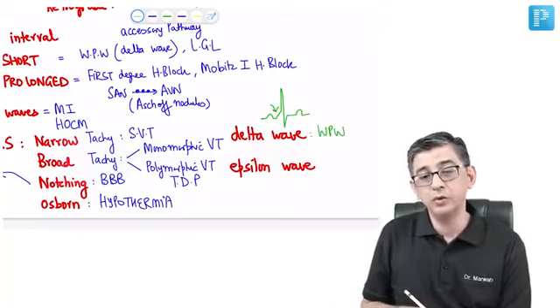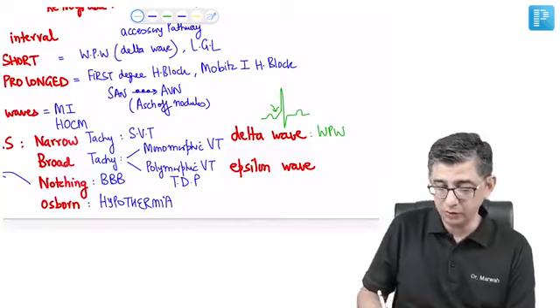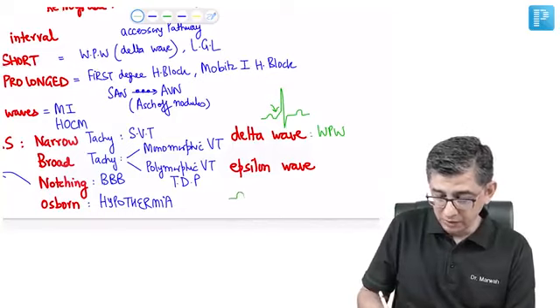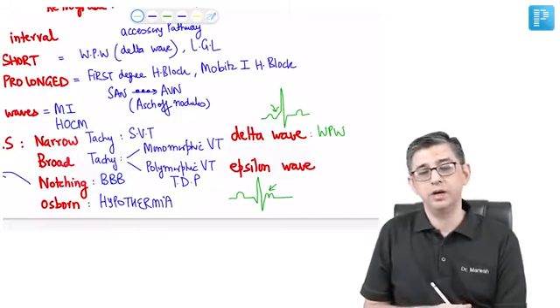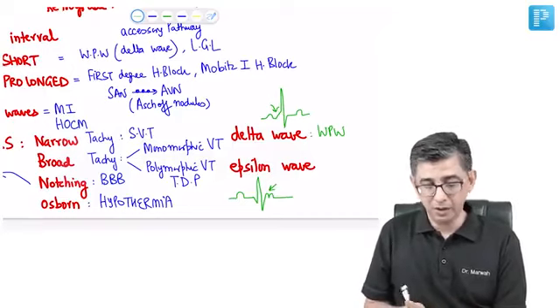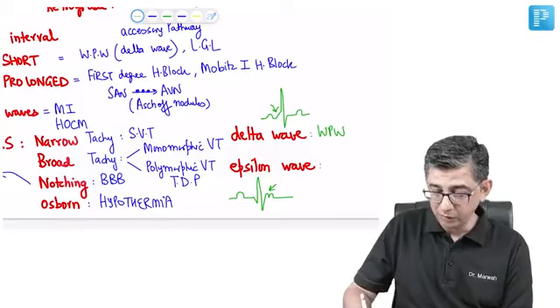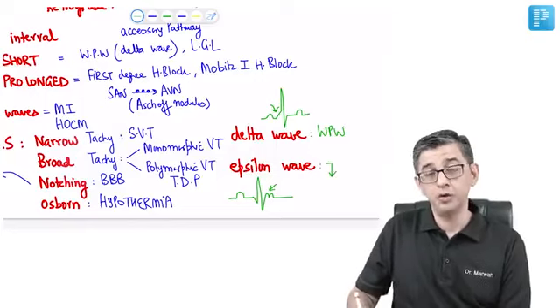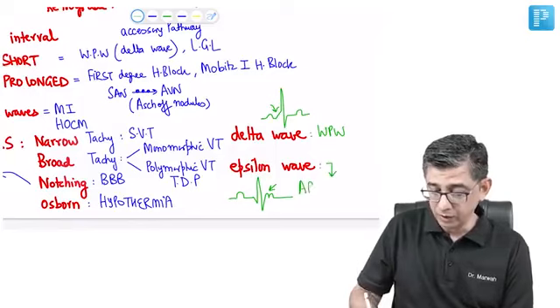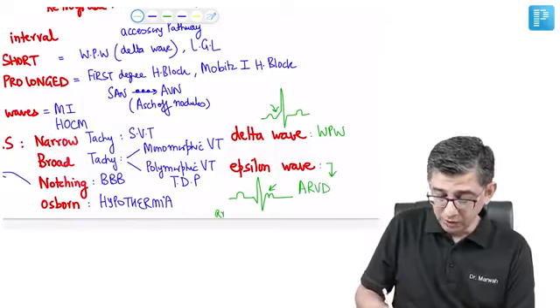In contrast, the epsilon wave can look notoriously almost the same as the Osborne wave. And well, let me just sketch it and then I'll be able to do justice to this relatively better. This wave that I have currently shown at the end, you see, Osborne wave also occurs at almost the same time. That is where I've shown the epsilon wave. But this epsilon wave, if asked to you in theory, you should be spot on in your answer, because this would be cardiomyopathy by the name of ARVD and can contribute to sudden cardiac death.